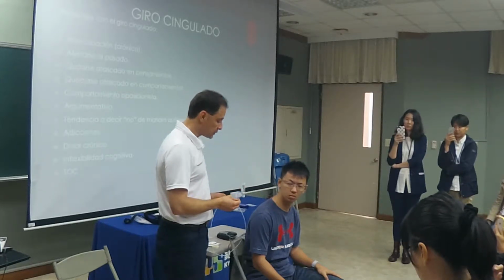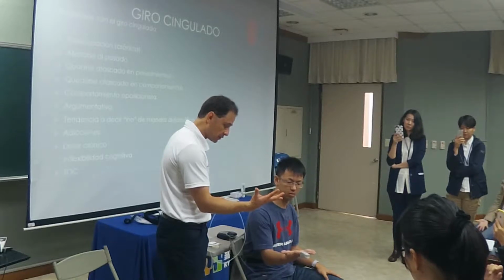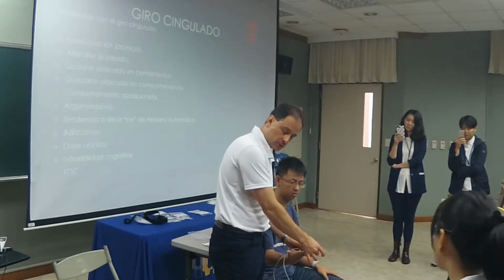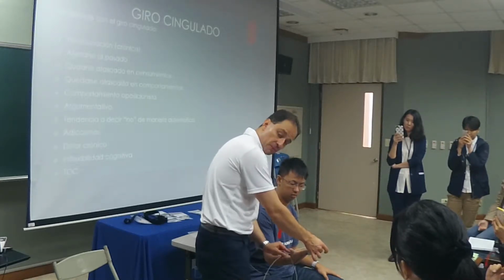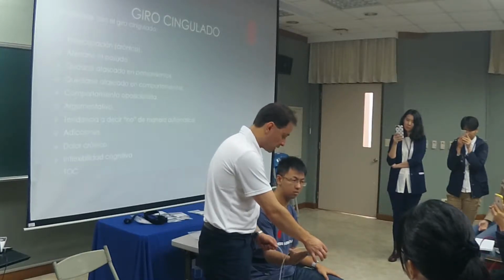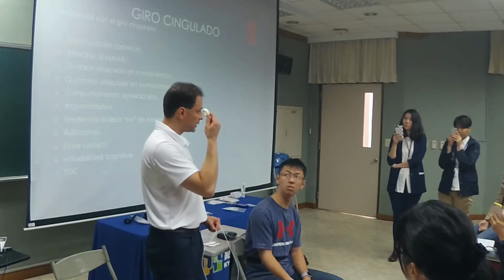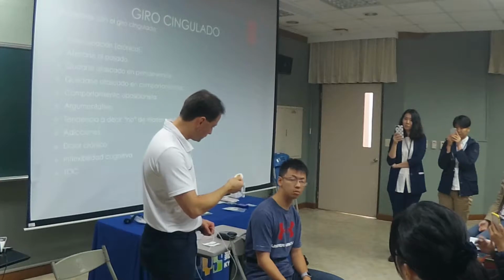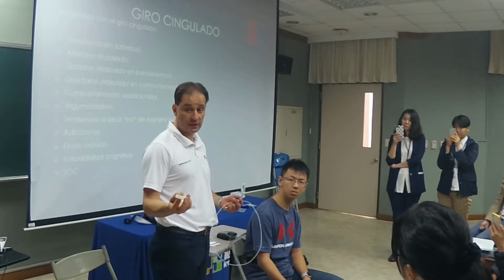What I'm going to ask you to do is raise your hand a little bit and spread your fingers out like that, a little more. There you go. I'm going to place it on the middle fingers. I'm going to tape it over here, and then I might tape it to the palm of the hand or the forearm, if it's not too hairy. The other reason I like the Coban is that some people are allergic to this type of tape, or the micropore. Are you allergic to it? No. So always ask, are you allergic to any products on the skin? Because if they are, you have to get resourceful.